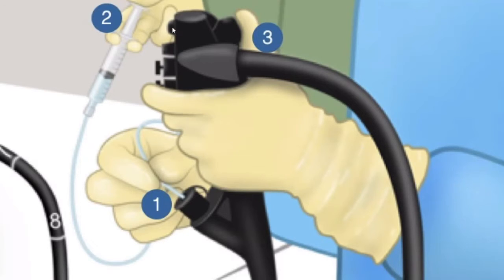And the third thing is, once you are inside the submucosa and you're creating a submucosal bleb, as the bleb is increasing in size, it's a good idea to slowly lift the tip of the scope, the big wheel pushing down, so that you could create the dynamic injection. So these are the steps to keep in mind to create a nice controlled dynamic injection.